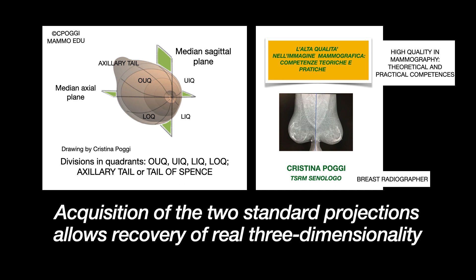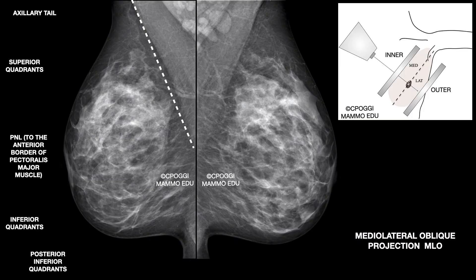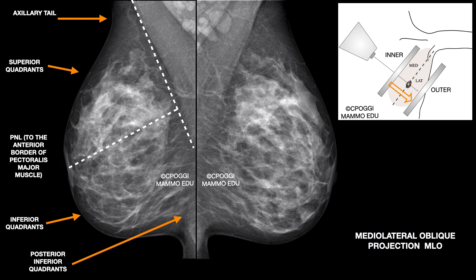Mammography is two-dimensional, but acquiring the two standard projections enables you to recover real three-dimensionality. This is the cranial caudal projection, CC, with superimposition of superior on inferior tissues — showing the outer quadrant, axillary tail, inner quadrant, and cleavage. This is the mediolateral oblique projection, MLO, with superimposition of inner on outer tissue. The superior and inferior quadrants are defined with respect to the PNL — posterior nipple line. This is the axillary tail. This portion, called the posterior inferior quadrant, is just above and in front of the IMF, very important to show in an MLO view.